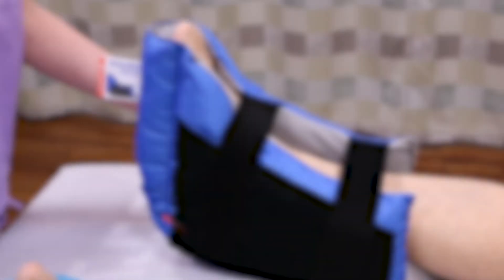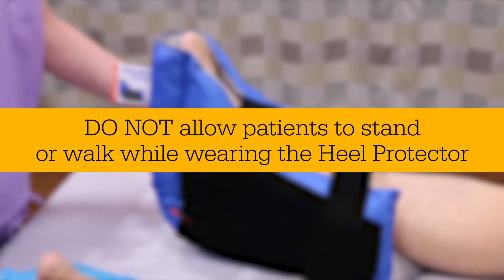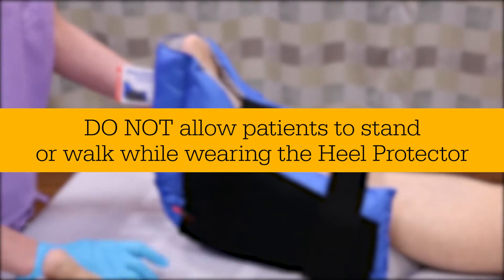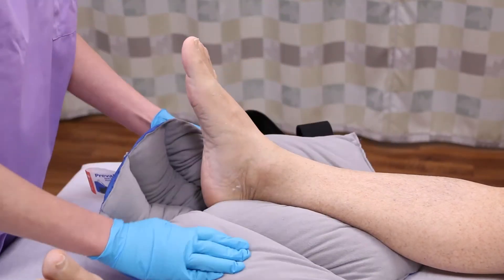The heel protector is for use on non-ambulatory patients only and should be removed prior to ambulation. Do not allow your patients to stand or walk while wearing the heel protector. The heel protector should be removed periodically to assess the skin according to your protocol.